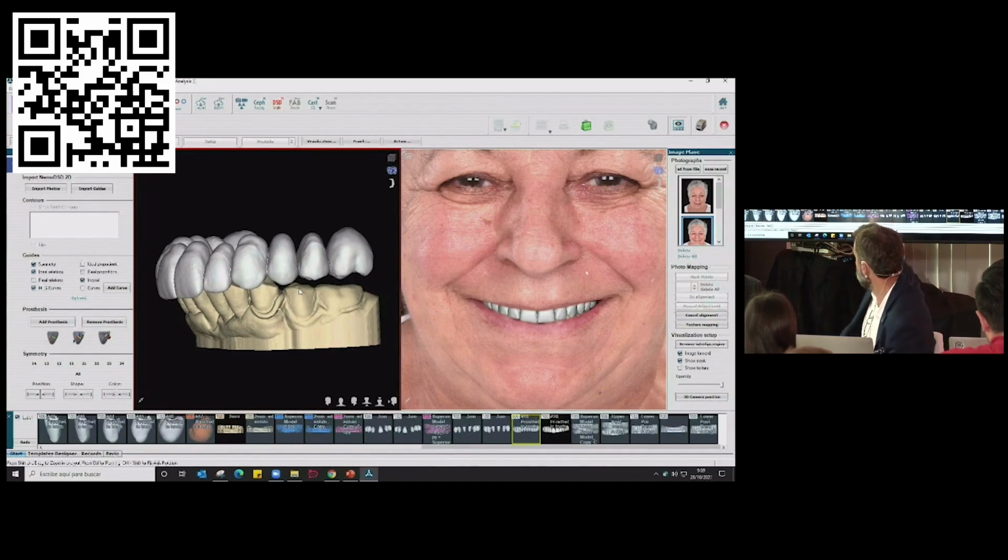So whenever it's too much like this, then we have to make a decision. Some dentists ask, no, it's okay, adapt. And I say, okay, we adapt. Because then for the final, I will correct this, I will do the lower, so then we put the occlusal plane. But I like the provisional to be as close as possible to the ideal design always, right? So what we're going to do here is add some composite. She has a removable on the lower, so we're going to build up some composite, very easy on the lower.